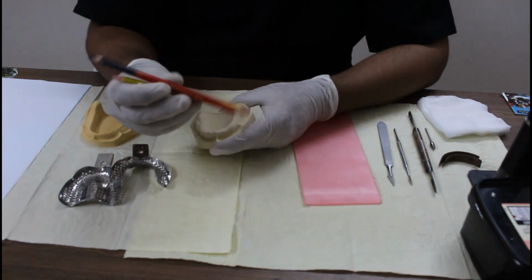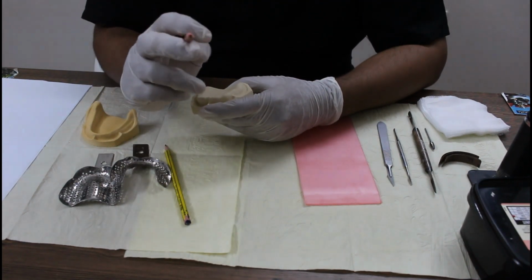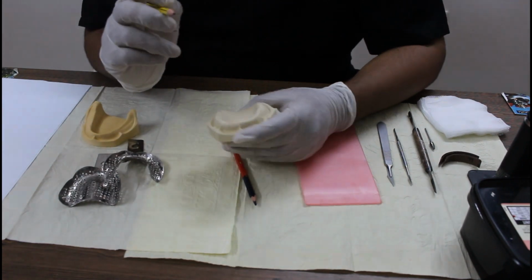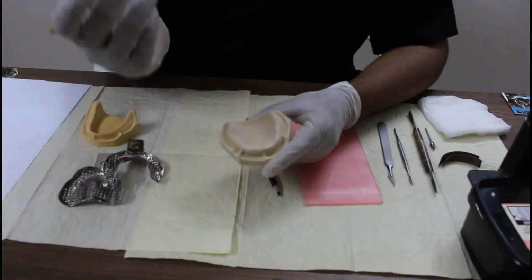Like in anatomical landmarks, we need 3 color pencils: a normal pencil, blue and red. First we will mark the limiting structures that we told you in the landmarks with a normal pencil.